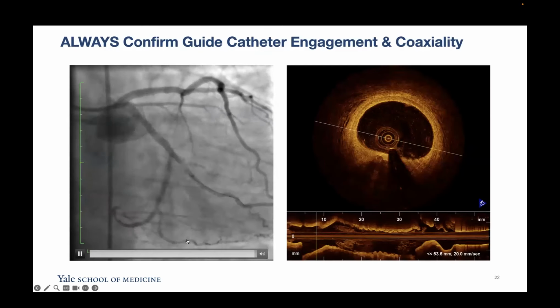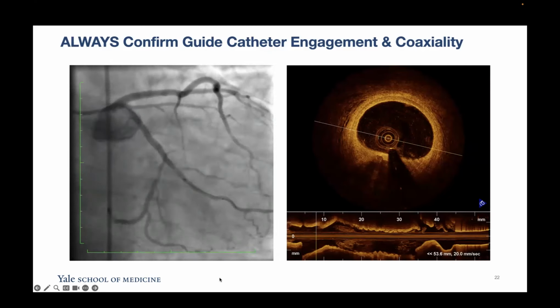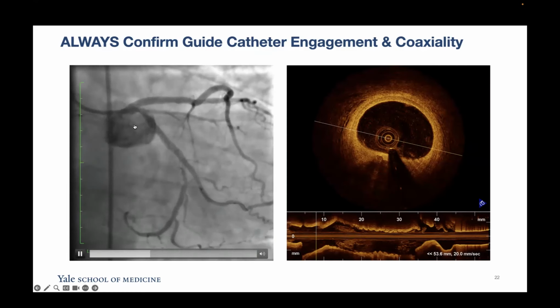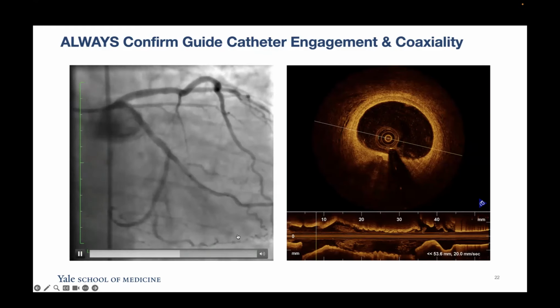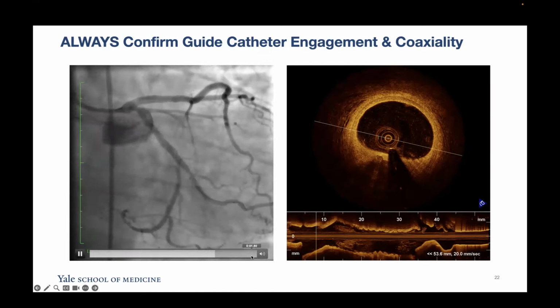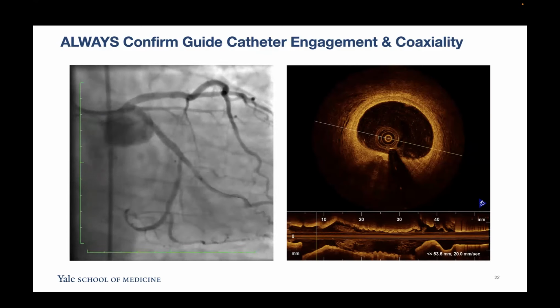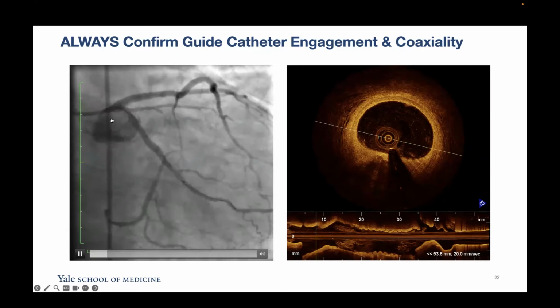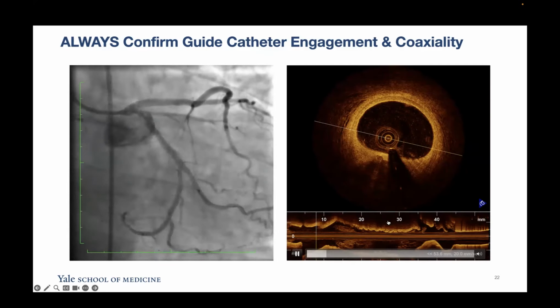So this is one example, from the time of the BRS, the bioresorbable scaffold. We did a stent in the circ. You have your guiding catheter. For a cine, this is enough. You see the wire there, you see the OCT catheter. That's okay for an angiographic interpretation, but you see that there is a lot of escape of contrast to the aorta. There is a lot of recirculation back to the sinus of Valsalva.